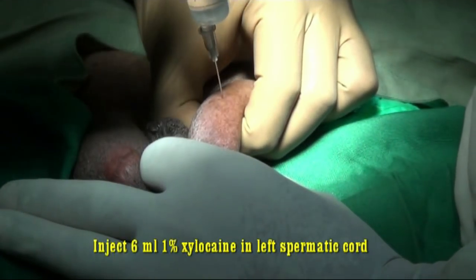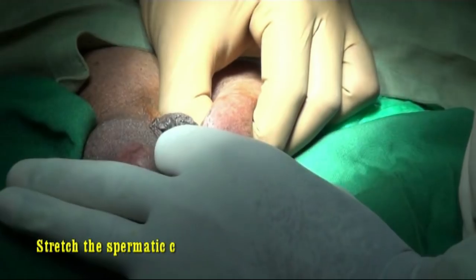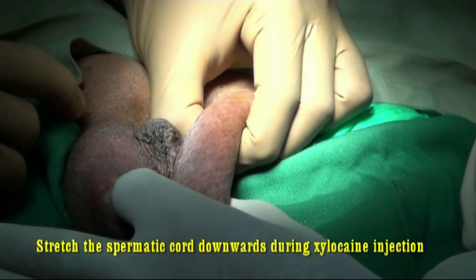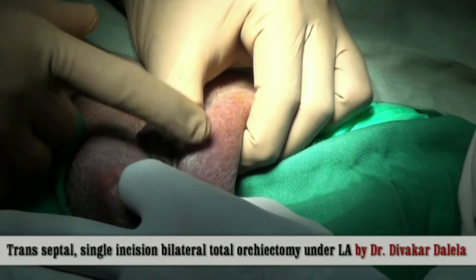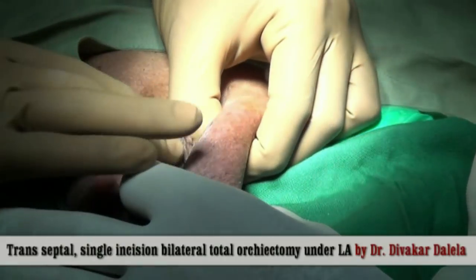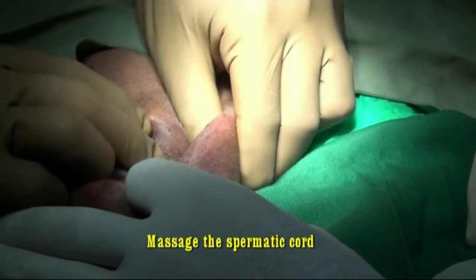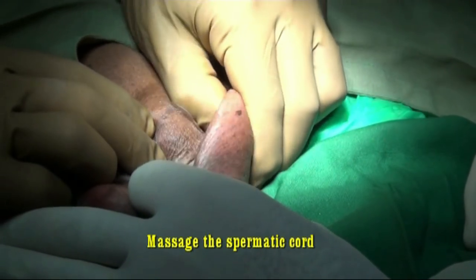It is necessary that the cord is put to stretch — the assistant stretches the testes down. This manual stretching stretches the cremaster fascia and muscle so the cord gets elongated, and the drug that you inject will diffuse downwards towards the testes and upwards towards the external inguinal ring. This stretch on the spermatic fascia is necessary. After you have infiltrated the drug, this spermatic cord needs to be massaged 2–3 times. By the feel of the massage you will know that the drug is in the spermatic cord.